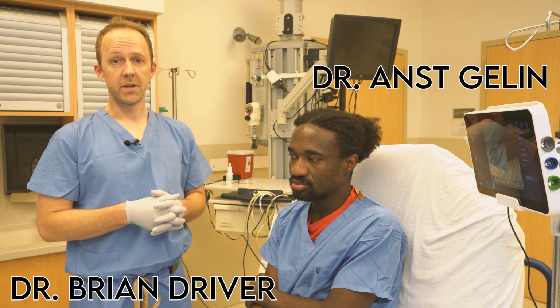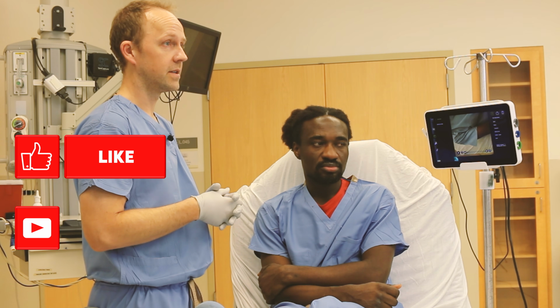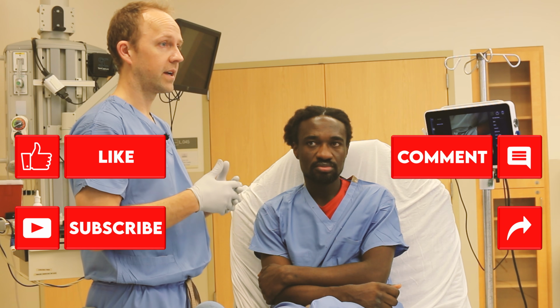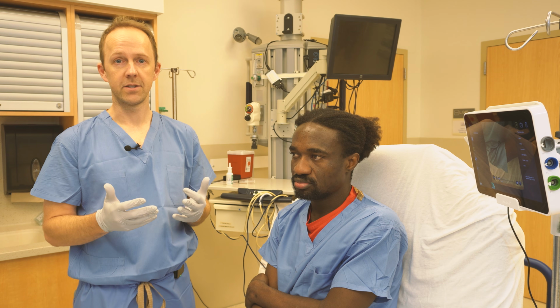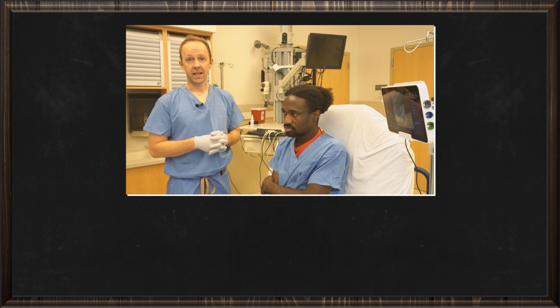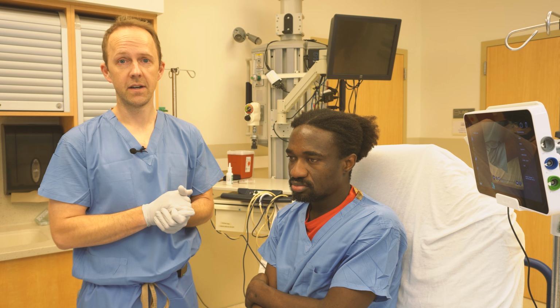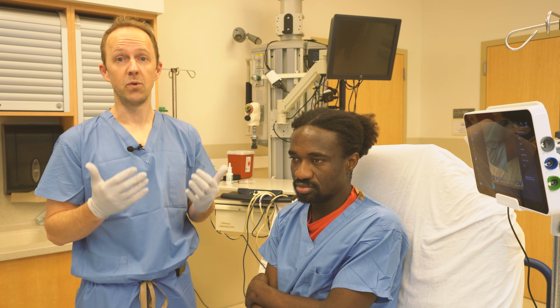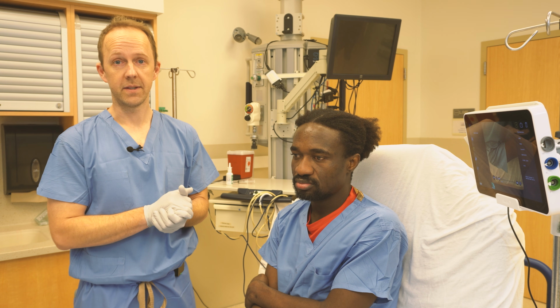Okay, so before you start the procedure, it's important to have everything ready, including rapid sequence intubation drugs and laryngoscopes and everything you'd use for intubation, just in case anything happens during the procedure where you have to intervene. One question we commonly get asked is what sedative we should use to help facilitate the procedure. The reason we're doing this procedure is because someone has a really difficult airway that we think is too dangerous to give them rapid sequence intubation.